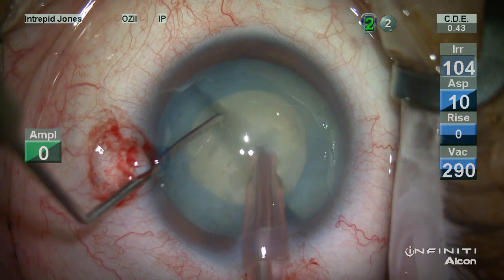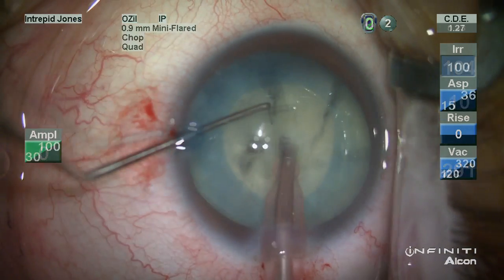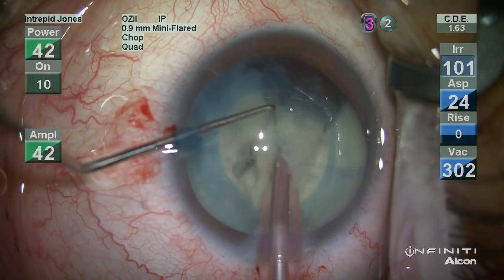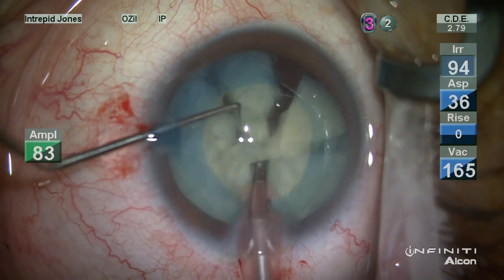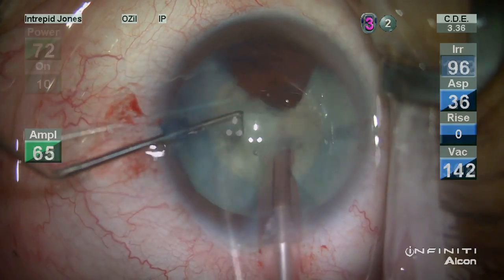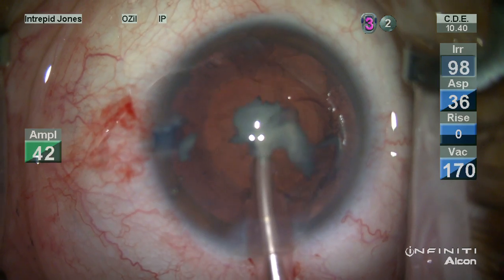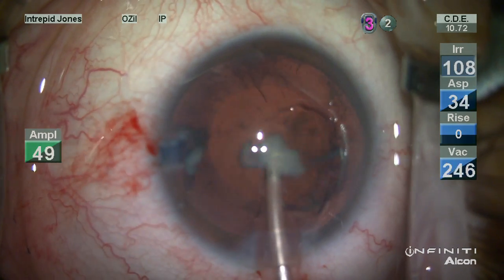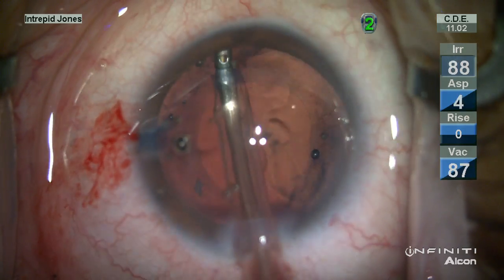The standard FACO chop is then performed. Once the pieces are created, they rather readily emulsify. It's important to keep an intact posterior capsule.